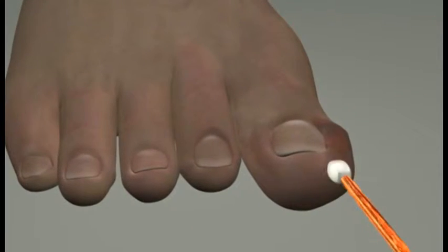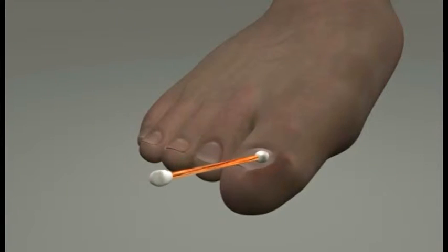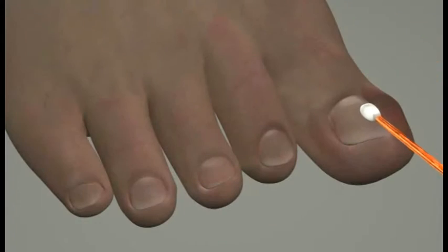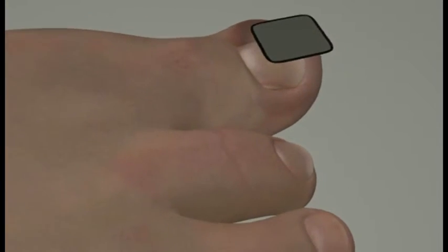First, the nail surface needs to be cleaned using a cotton swab. If necessary, one can use sandpaper or a Dremel device.